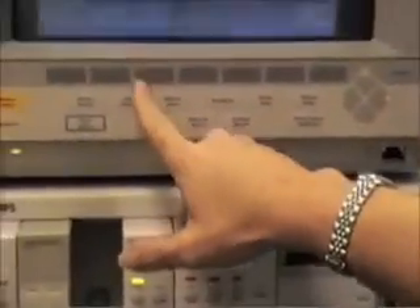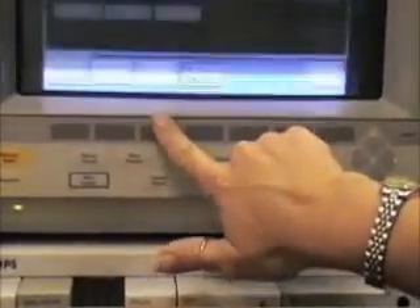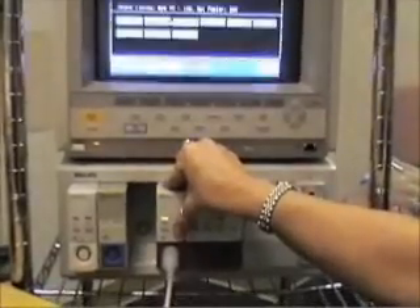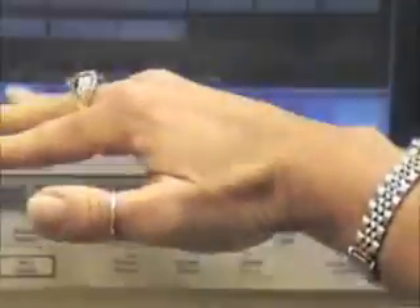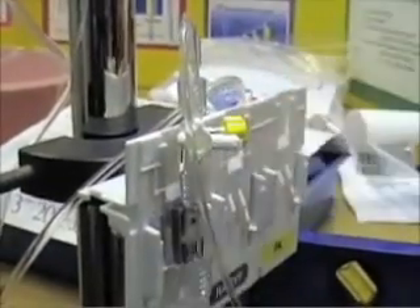Two ways you can do it: you can either zero the transducer at the monitor, or you can press zero on the module itself and it'll do the same thing. It'll beep, and in the lower or upper left corner it's going to tell you CVP zeroed at such and such time on whatever date. Once you see that, go back to your transducer and replace your vented cap with a non-vented cap, and turn it off to the cap.